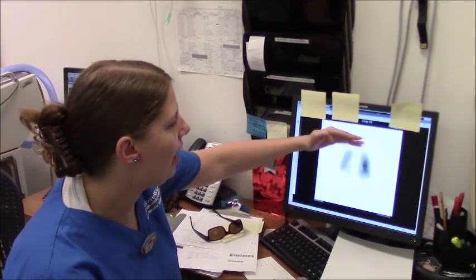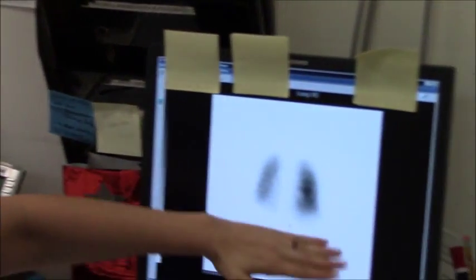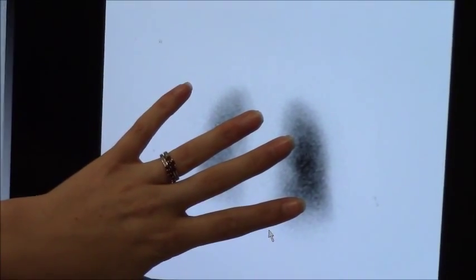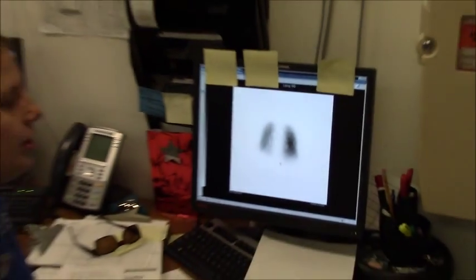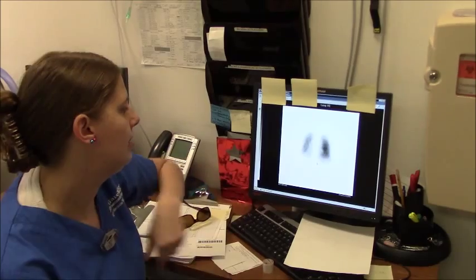So it's easy to tell that you have all of the top of the lungs in, and to make sure that you're not missing any of the bottom. You can also see on the sides are both in there. Now we'll have an image like this for each view we took. We had 4 positions, but we were taking 2 pictures each. So we really have 8 images that look like this.